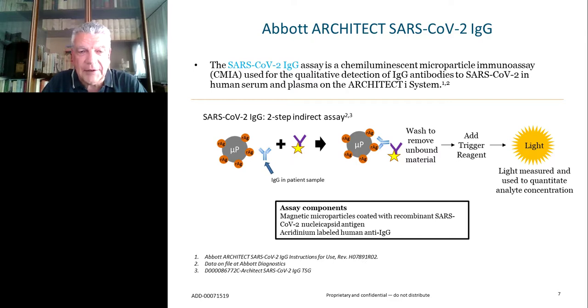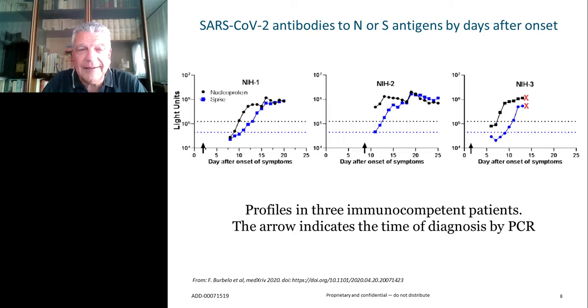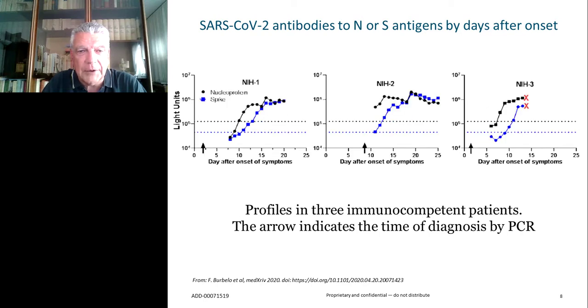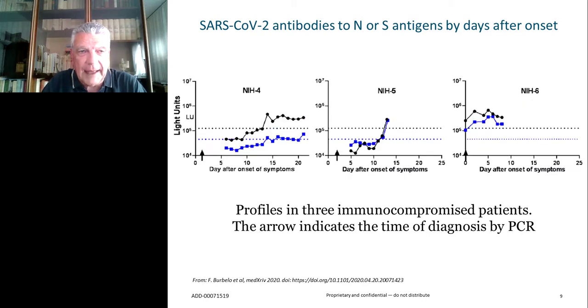Let's start with the target selection you see here. As you know, the most immunodominant regions are the spike and the nucleocapsid ones, and assays may target one or the other according to which is the preferred need. So, having selected the nucleocapsid was based on the fact that during infection, nucleocapsid antigens are usually expressed to a higher yield compared to spike, and as a consequence, the antibody response towards nucleocapsid tends to appear earlier and possibly stronger. You see here, immunocompromised patients, and here immune competent patients, how it may happen.